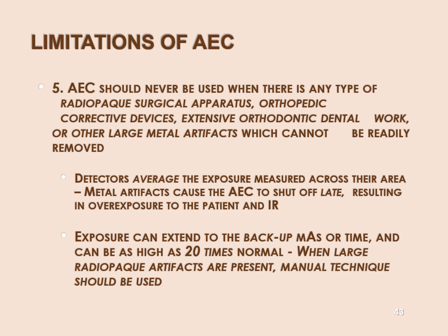And so if there's a big chunk of metal right in front of the chamber, what's going to happen to the primary beam when it hits that prosthetic? It's going to be absorbed by the prosthetic. So what's the remnant beam right behind the prosthetic? It's basically got no photons at all. So if the prosthetic is covering the chamber, you're never going to achieve ionization, and you're going to overexpose.